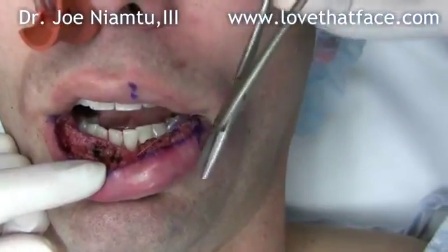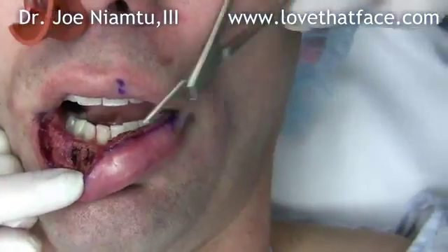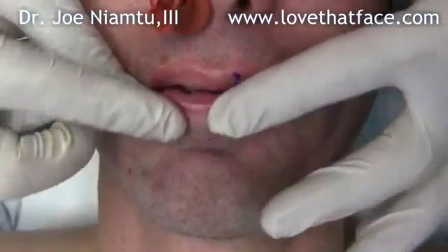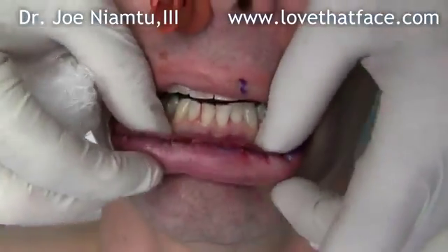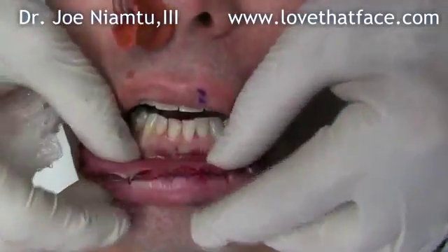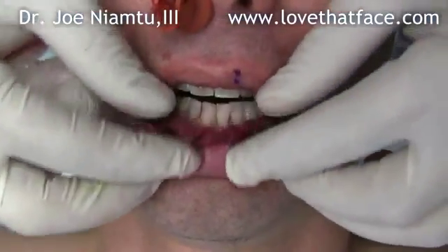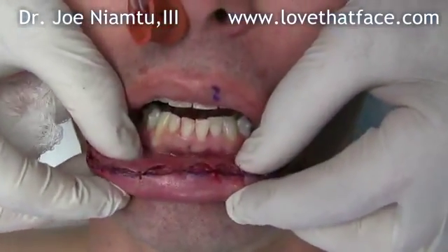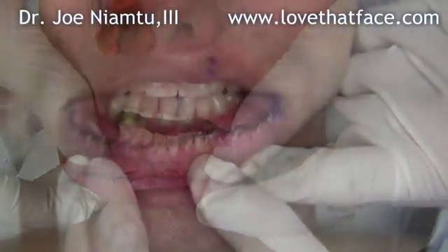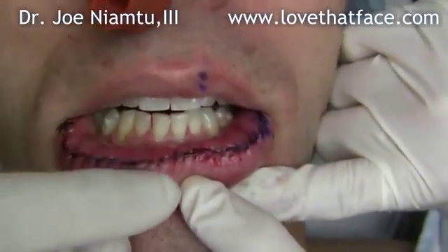We're going to put several key sutures in here to line our anatomy up properly. Now we've put our key sutures in — this just helps line up the mucosa and it's going to turn the lip in. Because of the swelling and the local anesthesia, there's a little bit more art than science at this point. But generally, if you've measured it correctly and have a symmetric outline, it should pull everything back in a nice, symmetric manner. We'll go ahead and put our final 6-0 silk closure in and then we're done. This took about 25 minutes.